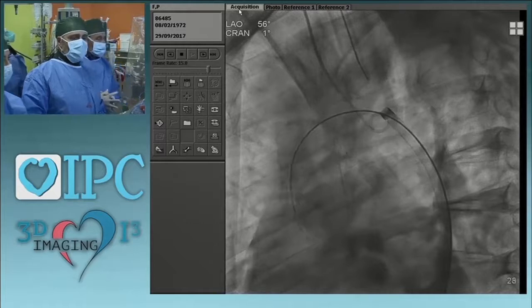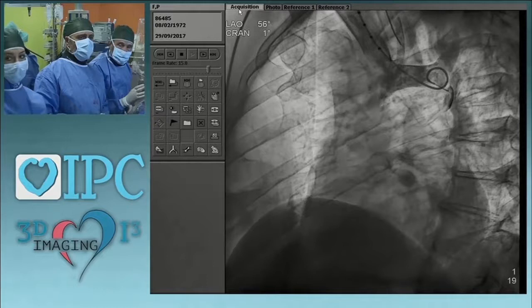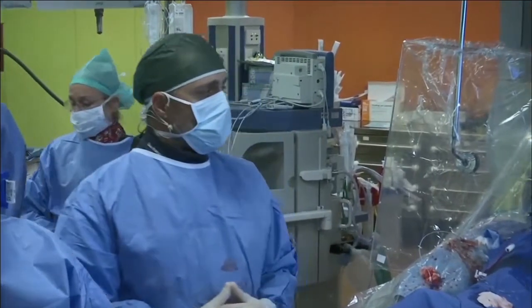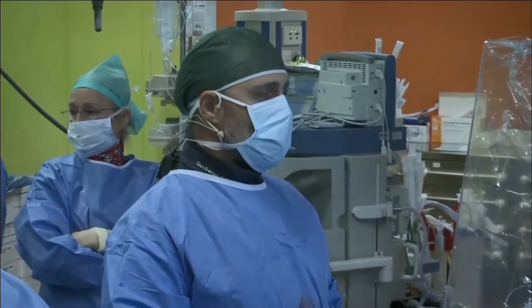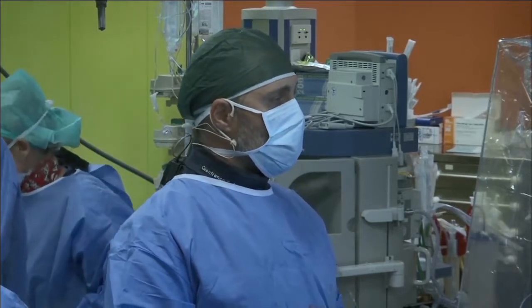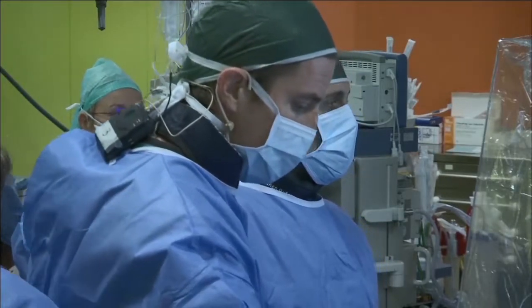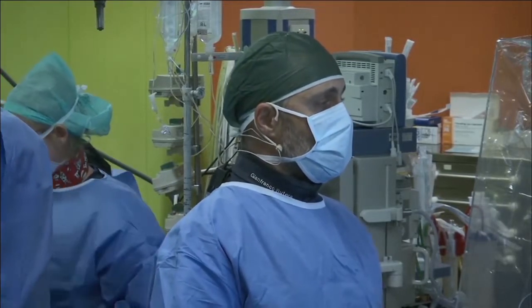Yeah. So, we are planning to implant a covered stent. That will be a CP covered stent because we do not have available the BeGraft stent of 12 millimeters in diameter, and we feel that 14 would be a bit too much in that case. This patient is also an adult, 45, bicuspid aortic valve, and we feel that probably tissues are a bit more fragile than, for example, an adolescent in a similar setting.